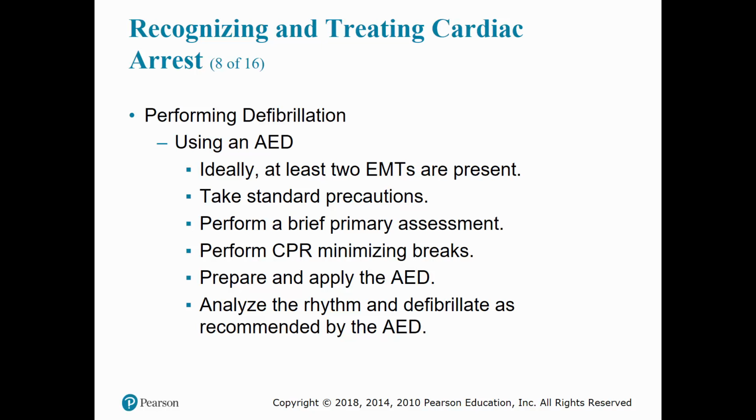There are 2 different AED pad placement options. Anterior lateral placement: one pad is placed on the right side of the anterior chest directly below the right clavicle, and the other pad is placed on the left lateral chest.